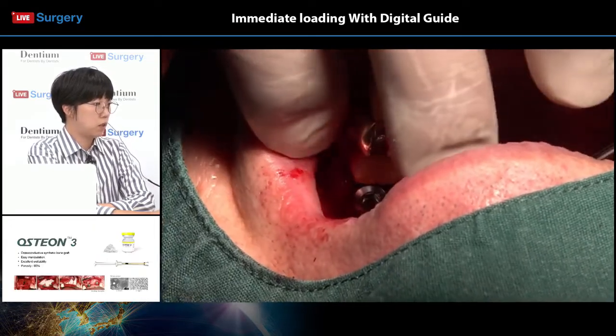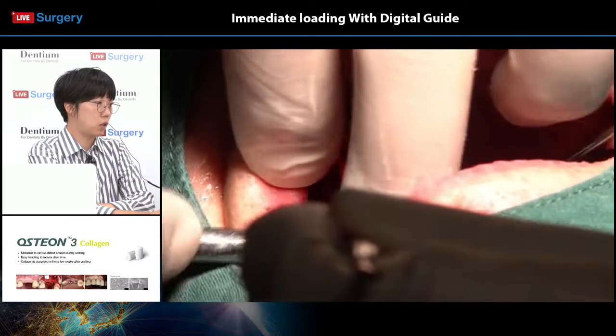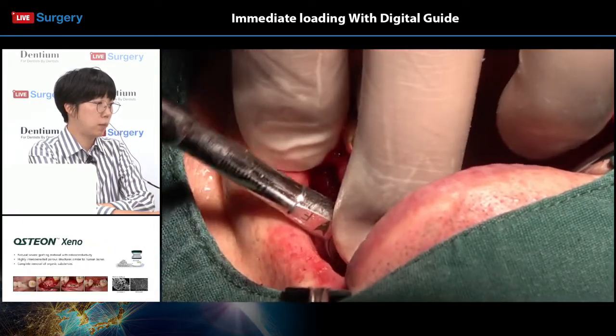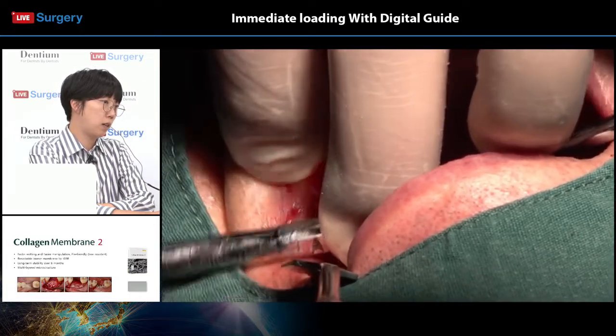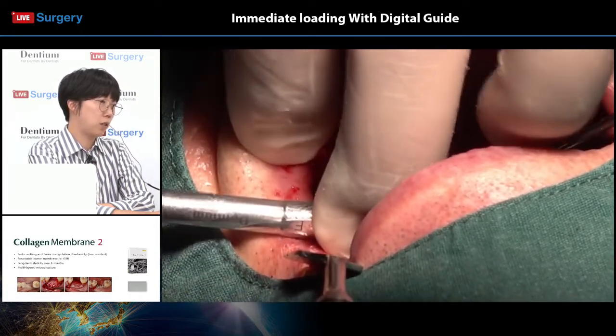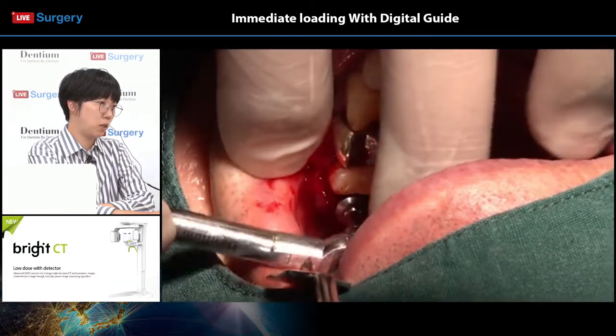By doing this, the surgeon can have more direct access to the surgical site as well as tangibly assess the bone and gum status. Okay, so I think the implant had to be inserted a little bit deeper, so Dr. Lee is performing that using a hand ratchet.